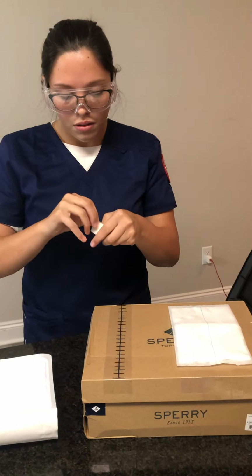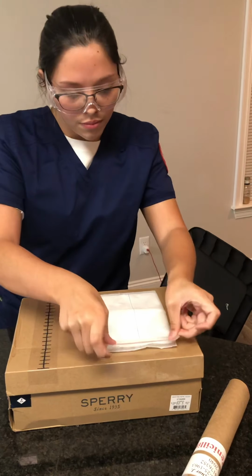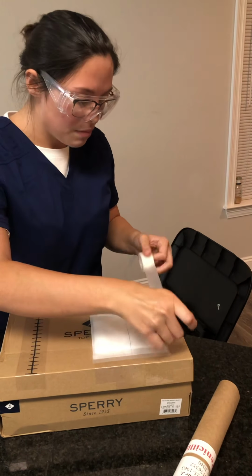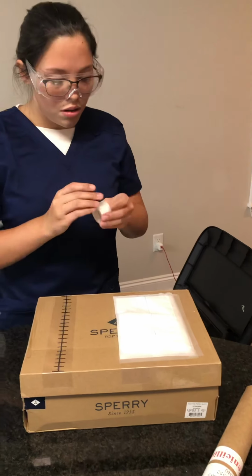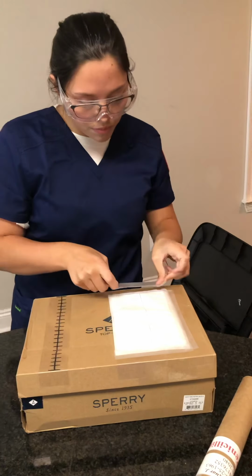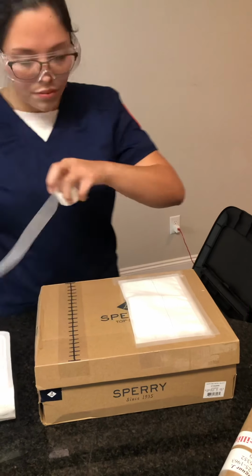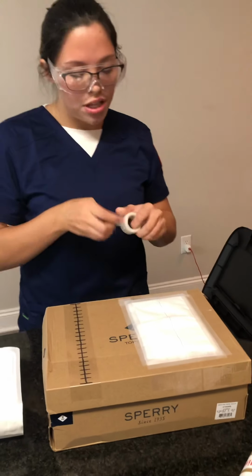I will then grab my tape and measure the sides of the ABD pad. Once applying the tape on the ABD pad, I will grab another piece of tape to place on top of it with my initials, the date, the time of the wound procedure.